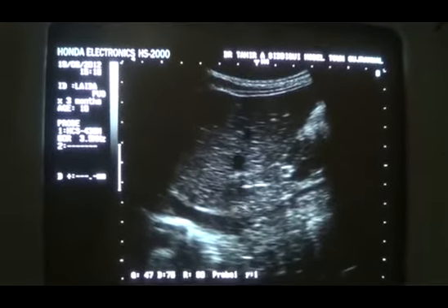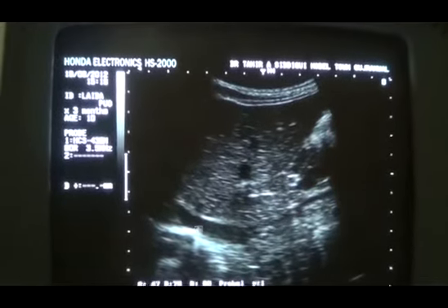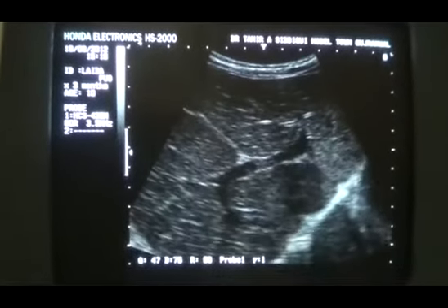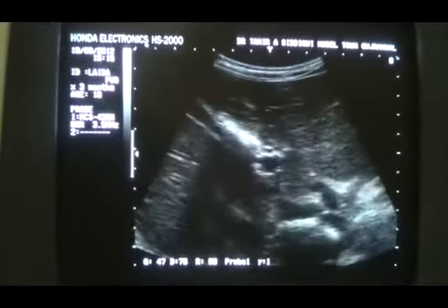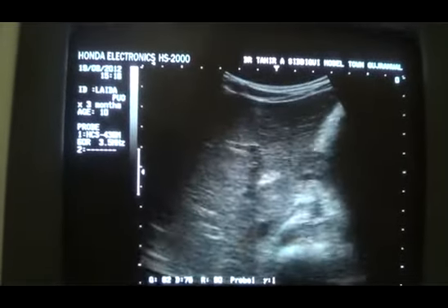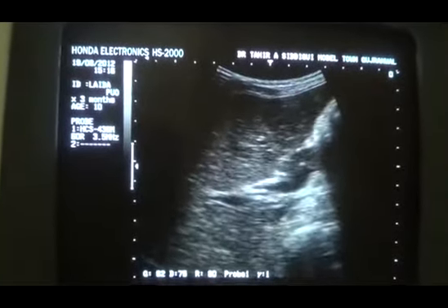This is the caudate lobe of the liver, because it is bounded anteriorly by the ligamentum venosum and posteriorly by the IVC. Here I am seeing both the right portal vein and left portal vein together. This is the main portal vein at the region of the porta hepatis.